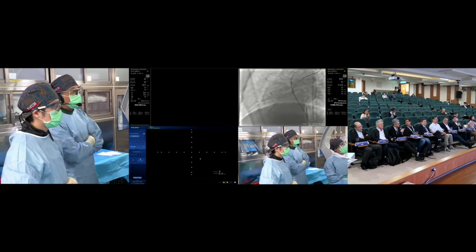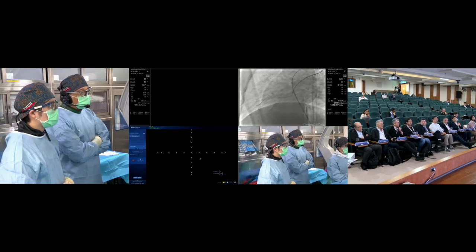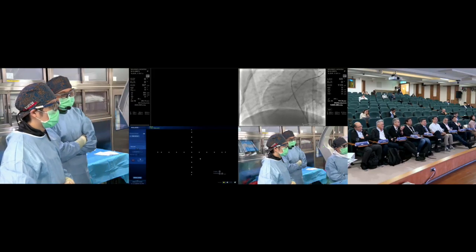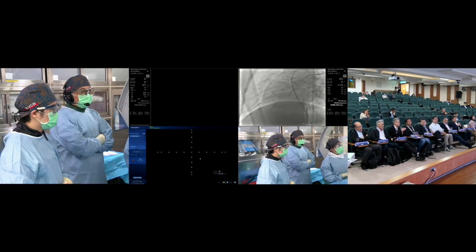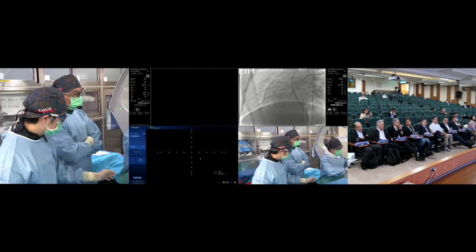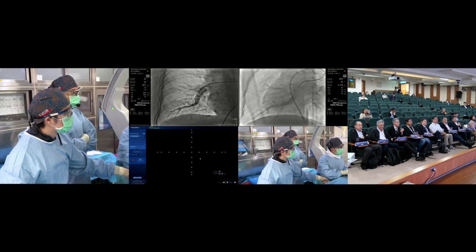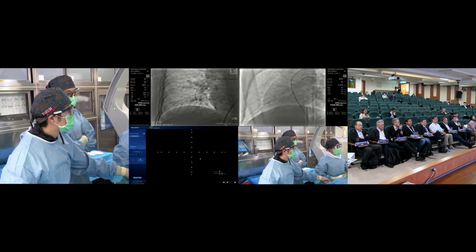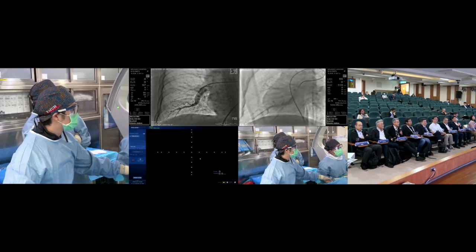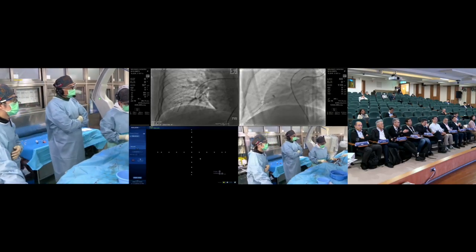And may I add that the data of coronary stenting in the pulmonary artery is very limited. So unless there is some really severe recoil, you will refrain from stenting. Chiefly because the distal outflow usually is not very good because of the pulmonary artery hypertension, so there's a lot of vasoconstriction. So the risk of stent thrombosis is theoretically a lot higher than in the arterial system. Right, that's right. Most of the time, restenosis or recoil usually happens in the more proximal branch instead of the distal branch. So maybe a peripheral stent in the main branch is sometimes needed, but not in the distal.